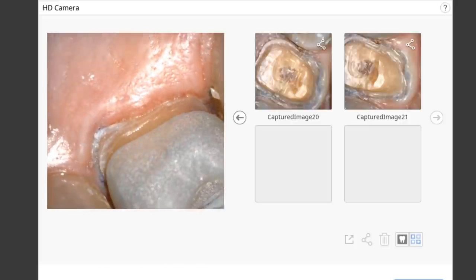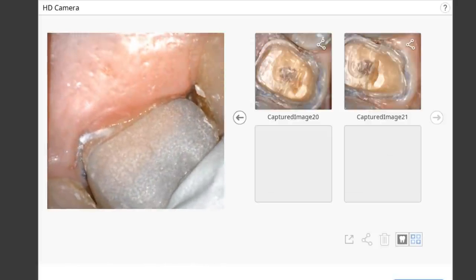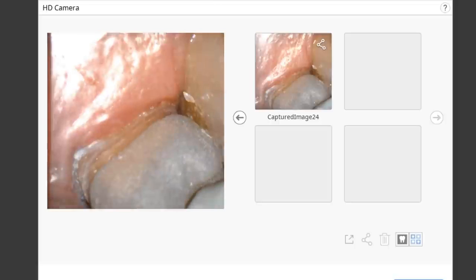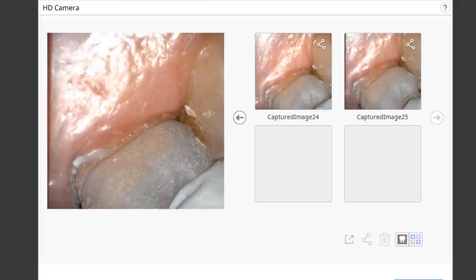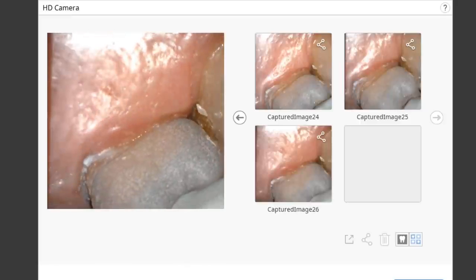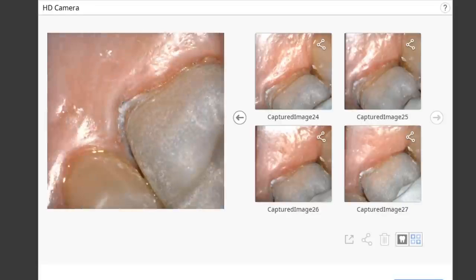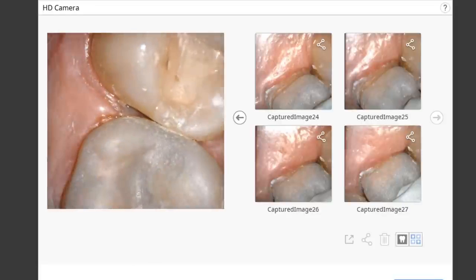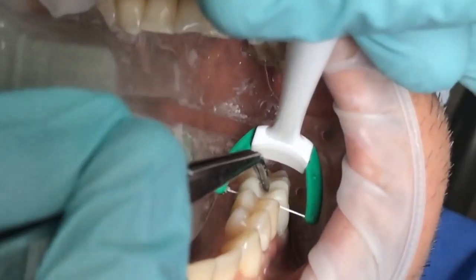You can see how flush it is to the margin of the preparation. So here, once I place enough finger pressure on the crown, it fits perfectly flush to the edge of the preparation. So perfect fit, perfect contacts, great contours that make the pre-op, and it's going to make the delivery very easy. And there's a sprue that we're going to detach and crystallize.